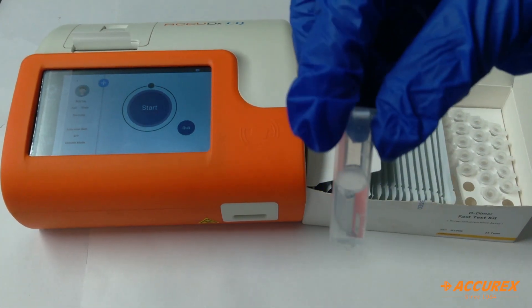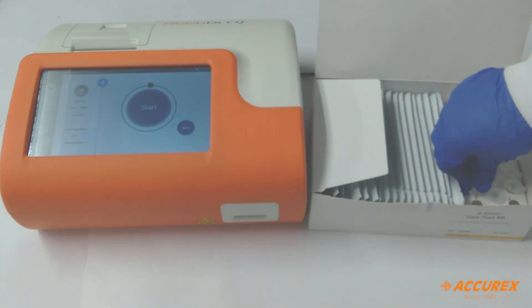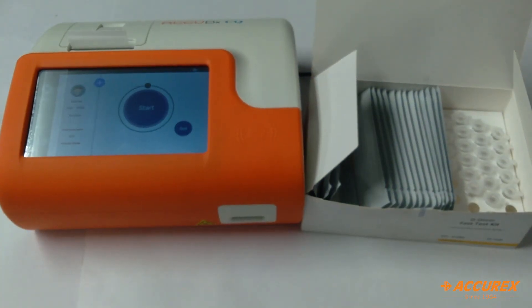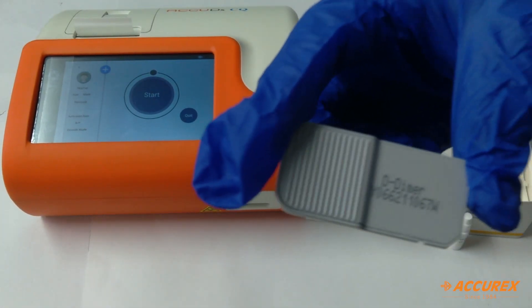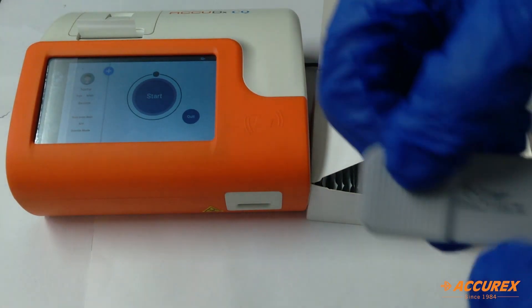These are the diluents. There is one buffer — when we use whole blood, we need to pour one drop of buffer in the kit. This is the SD card, so we'll insert this SD card in the SD card slot given on the left side.